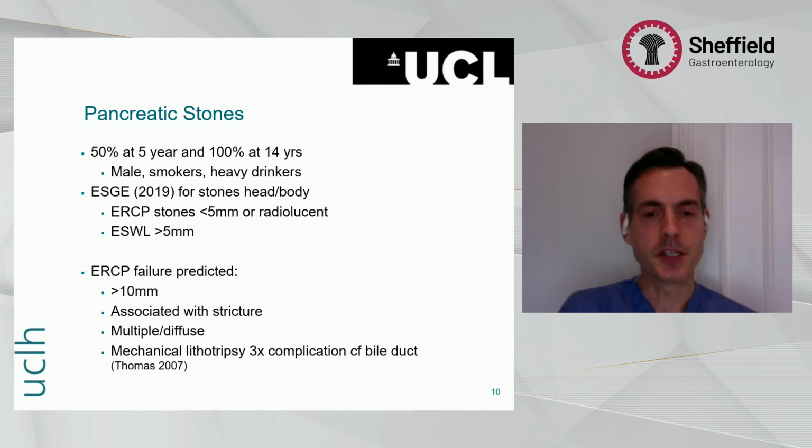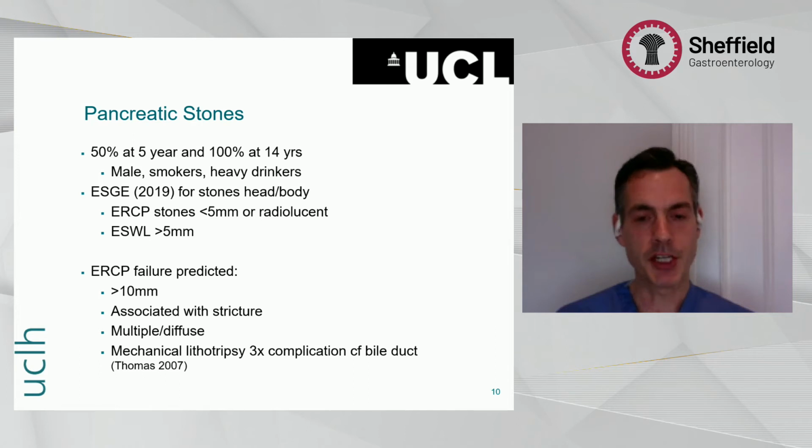Balloons you will struggle with because the stones often pop side branches. And if you undertake mechanical lithotripsy within the pancreas, be very, very careful. We've had certainly one episode of a mechanical lithotripter rupturing in the main pancreatic duct. And I'm sure all of our surgeons have received a call from a slightly sheepish endoscopist in the past to bail them out. The chance of having complications is 3 times that of the bile duct with the mechanical lithotripter. So be careful of baskets.